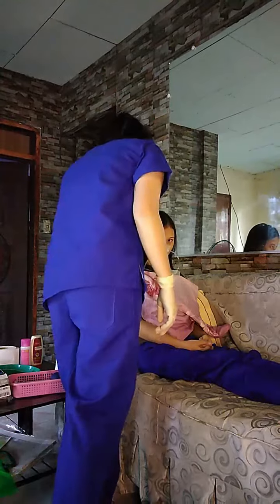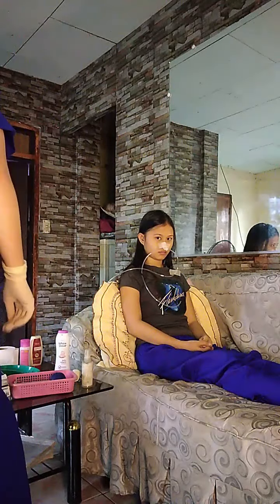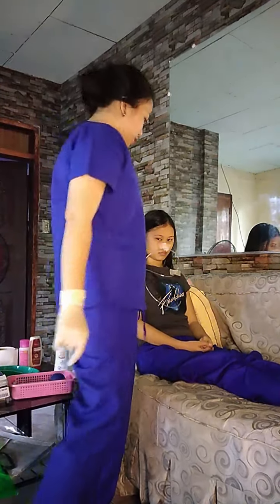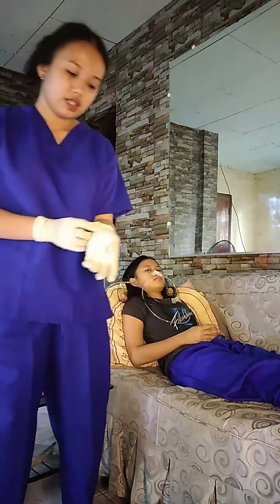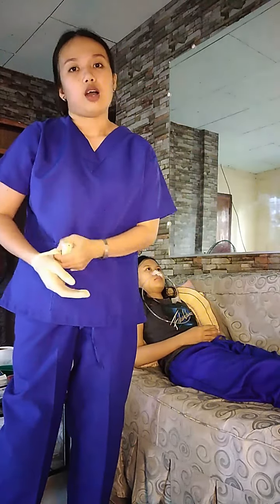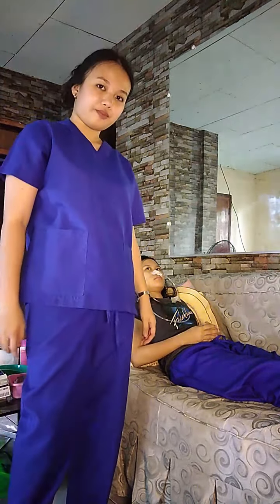And then, pagkatapos nun, alisin na natin yung drape. Dispose the equipments used. And then, position the patient to a comfortable position. Ayan. So, pagkatapos nun, alisin na natin yung gloves. And then, perform hand hygiene, and then document.